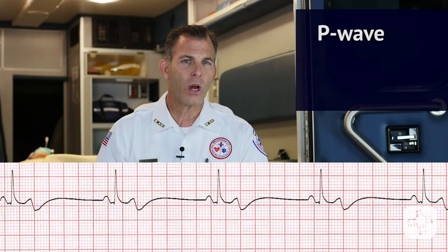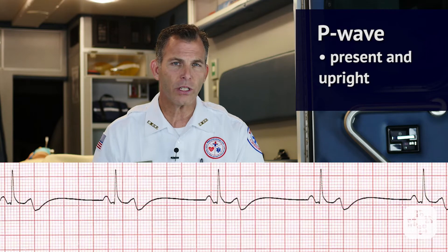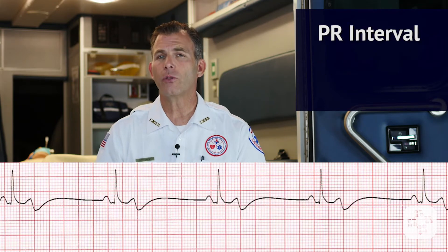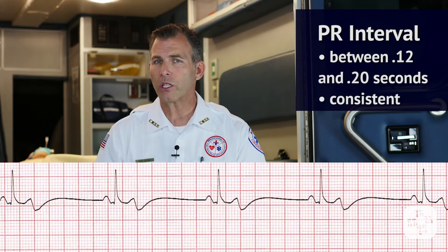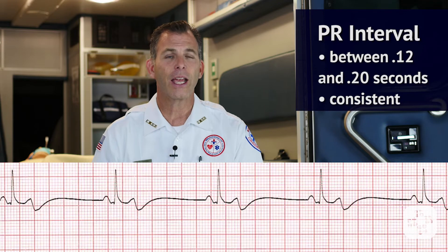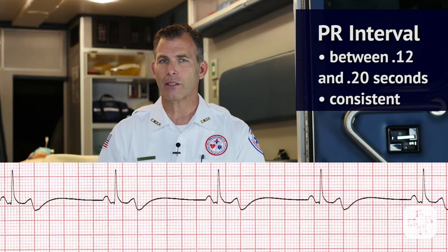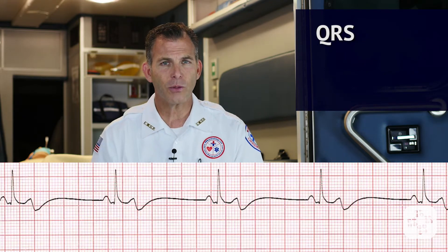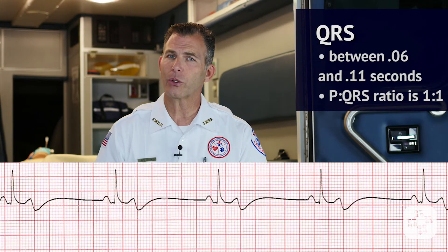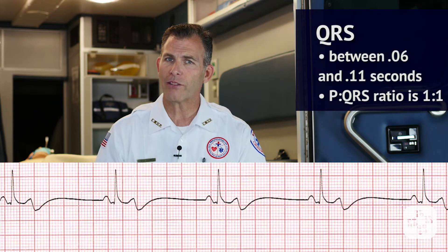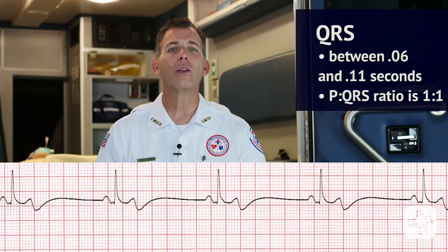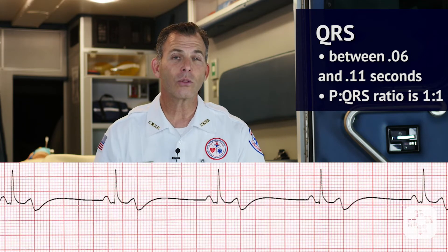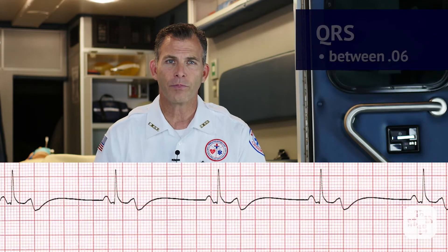P waves are present and upright with a P to R interval of between 0.12 and 0.20 seconds, and they're consistent. The QRS complex is between 0.06 and 0.11 seconds, and the P wave to QRS ratio is 1 to 1.